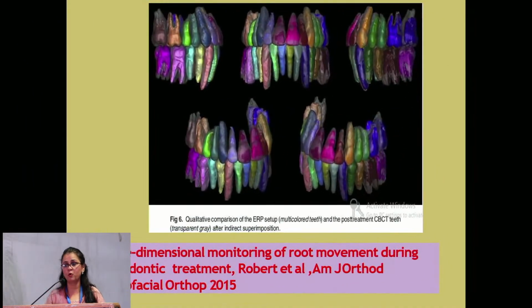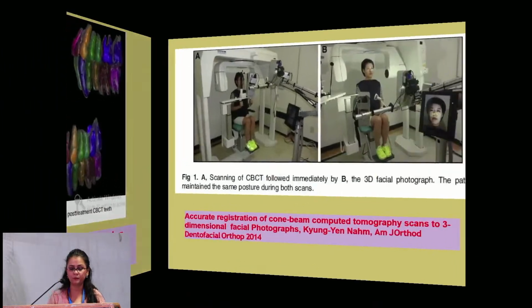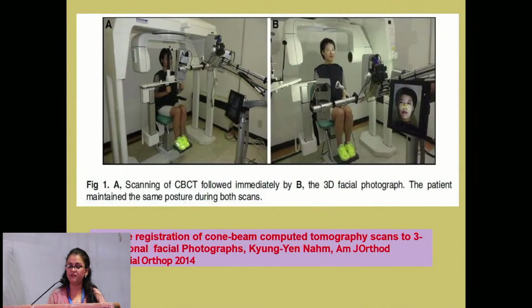Superimposition of pre-op and post-op can be done. This is known as a fusion aspect, where you fuse your pre-op CBCT with the post-op. But this also requires third-party software. 3D facial photography has also come, for accurate registration.